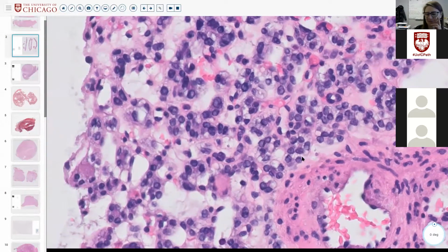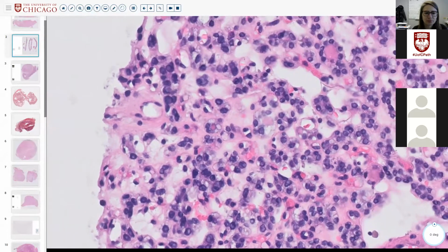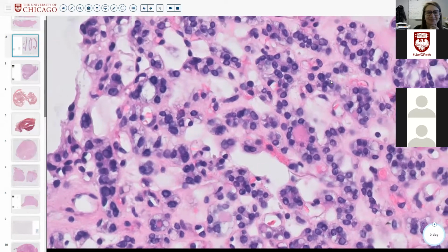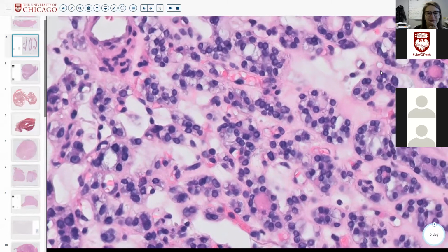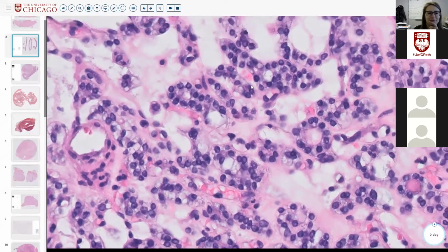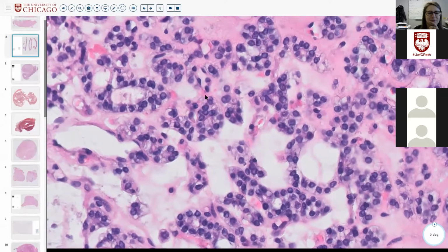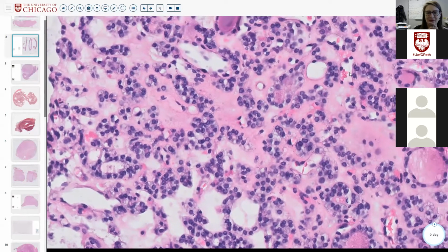there does seem to be some irregularities in the nuclei. So someone, Ryan, says pseudo inclusions. They could be pseudo inclusions, yes, but I feel like there are areas where there looks to be overlapping, but at the same time, what's the term? They're not smushed together. It seems like they're just forced onto each other. Crowded? Is that what you were thinking, Cindy? Crowding? Yeah.